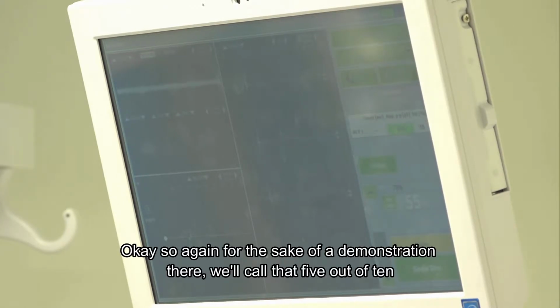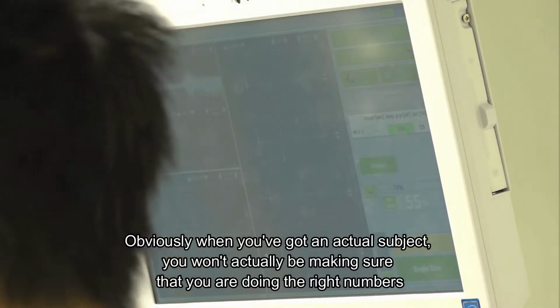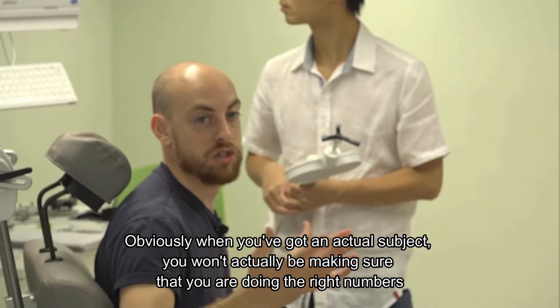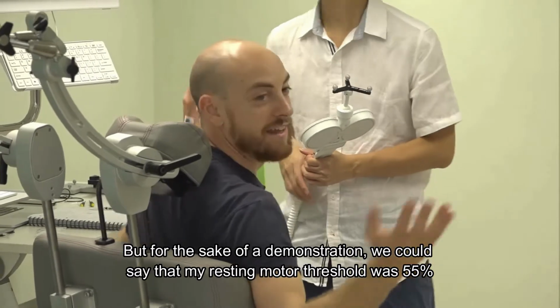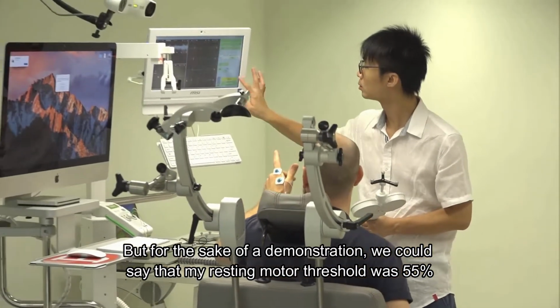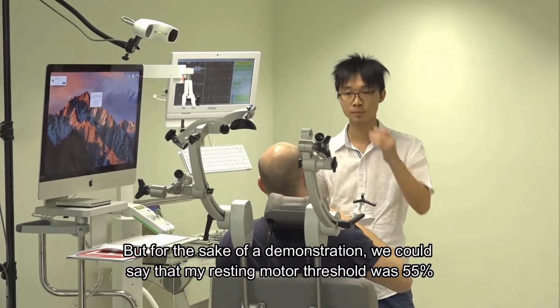Okay, so again, for the sake of a demonstration there, we can say that we'll call that 5 out of 10. Obviously, when you've got an actual subject, you want to be making sure that you are doing the right numbers. But for the sake of the demonstration, we can say that my resting motor threshold was 55%.